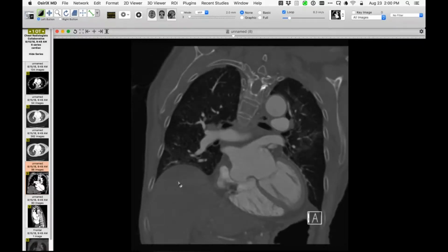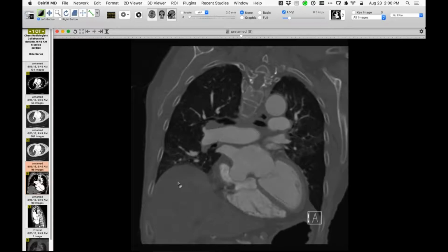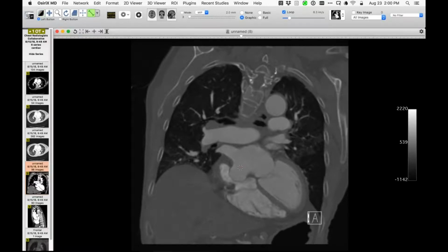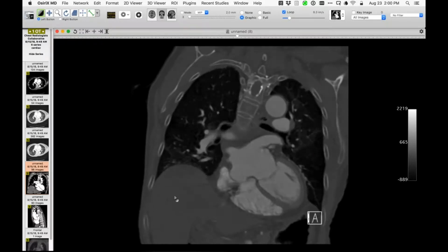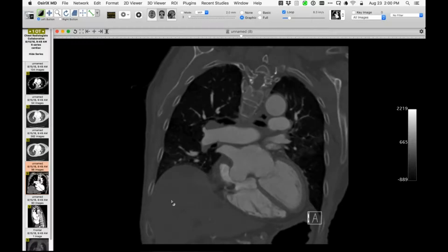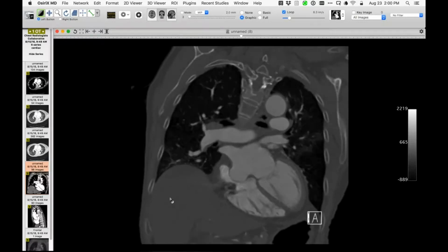And I think it's usually said that when you see that and you measure it, some people use a measurement. If this degree of bulging is more than 1.5 centimeters or so, this one's like 2 in that dimension, that's pretty typical for a septal aneurysm. So this one is of that size. Again, as an incidental finding. A nice example of that. Unless you guys think I'm wrong and it's something else.